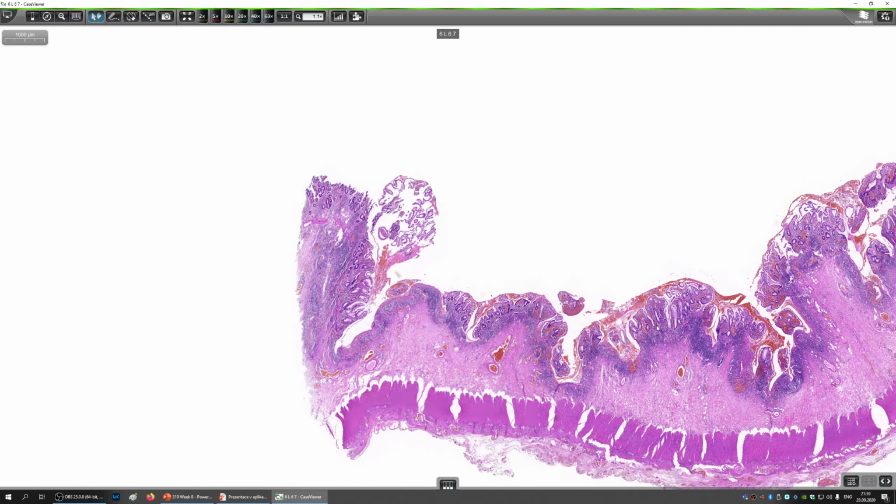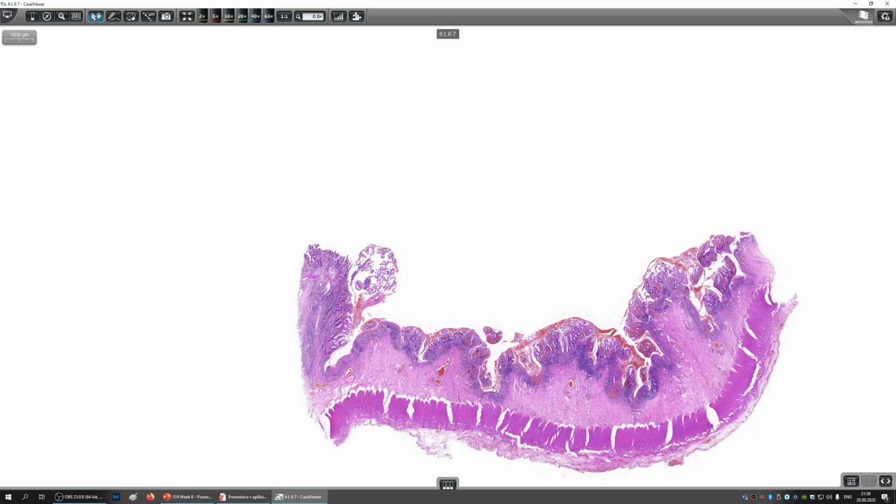And now what's the problem with a mucosa like this? You see it's very uneven. Especially in ulcerative colitis, if you have long-standing disease, there's a rather high cumulative risk for developing colon cancer. Like after 20, 30, 40 years of this disease, you can develop colon cancer. And if you have such an uneven mucosa, then it's very hard to say whether it's a pseudopolyp or whether it's a precursor lesion like an adenomatous polyp. So detection of dysplasia in long-standing cases of ulcerative colitis can be quite difficult.